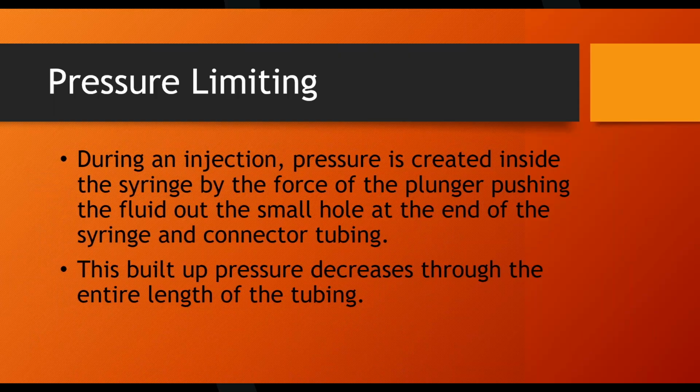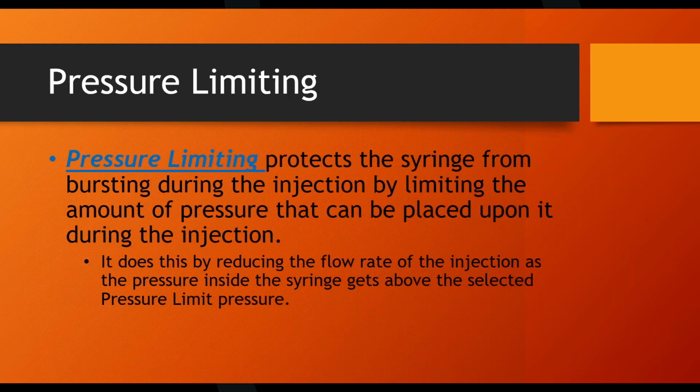Let's see what I forgot. So yeah, the pressure limit is a safety feature. It is for the patient, but not really for the patient. It's more of a safety feature so the syringe doesn't rupture during the actual injection, which is remarkably rare. It does happen sometimes. The contrast syringes, and this is true of all syringes, are one-time use only, at least here in the United States. Some other countries push that, but here in the United States, like every syringe, one-time use only. They use it, the procedure's done, it literally gets thrown away.